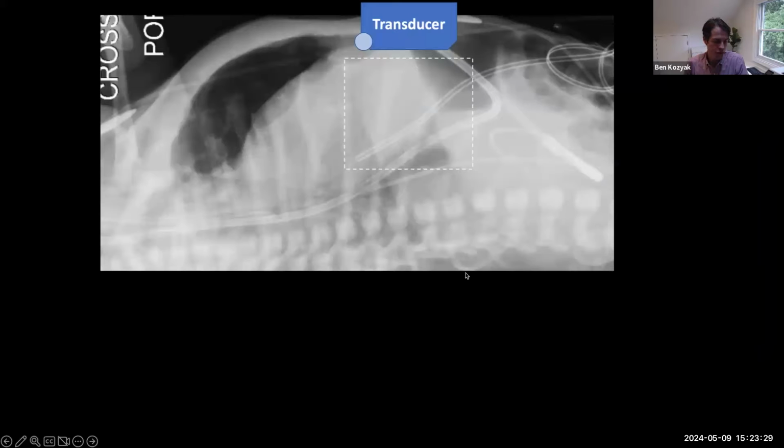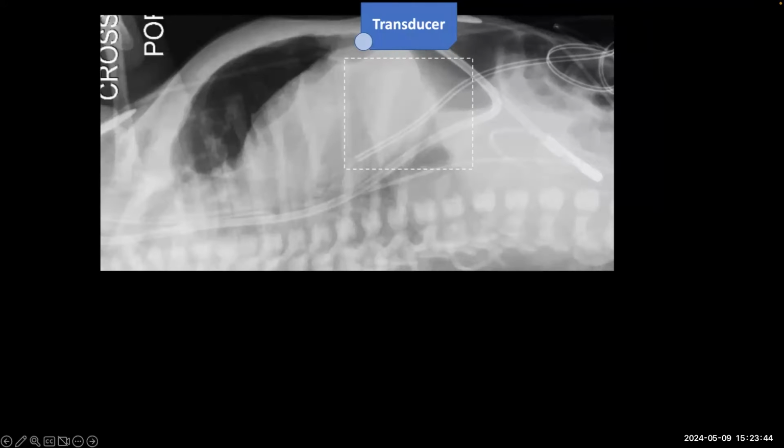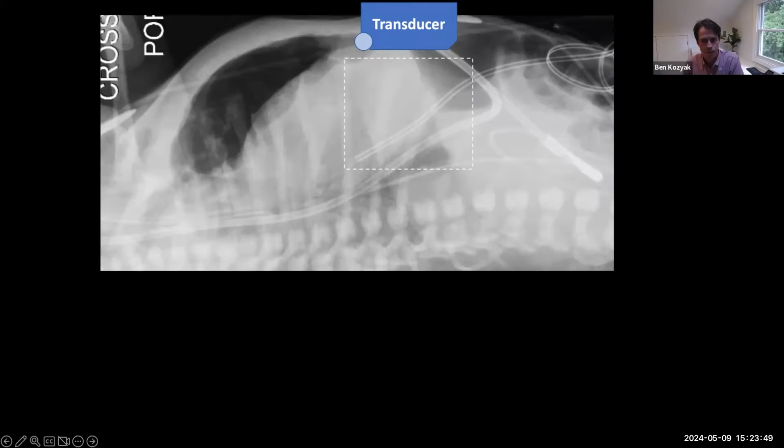So, like I said before, when you start instrumenting a patient's intravascular catheters, it's important to make sure that you're going to be able to do what it is you want to do. In this case, you want to make sure that the ductus venosus is patent. There are two ways to do that. I use both of them frequently. One is color Doppler, and the other is agitated saline.